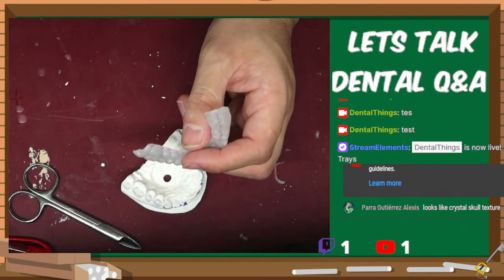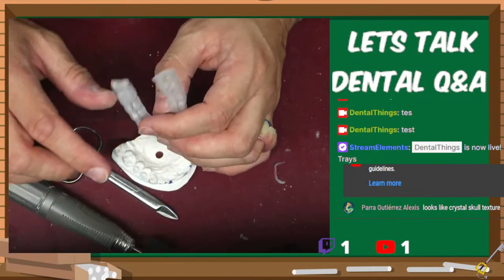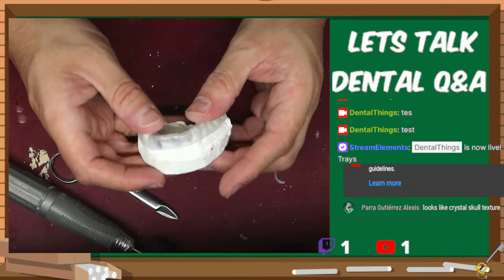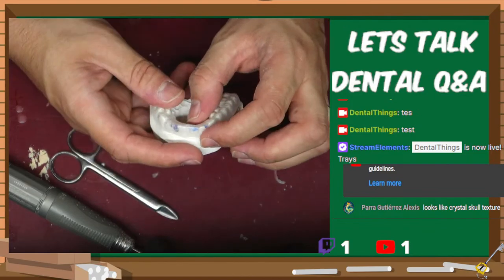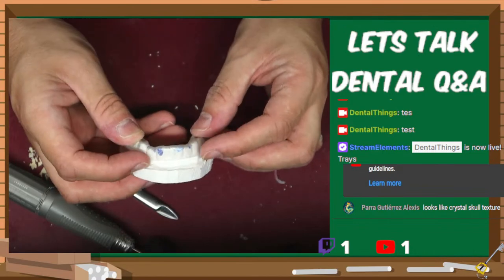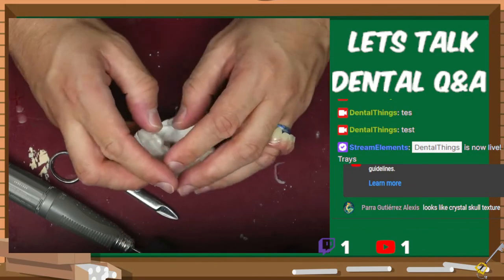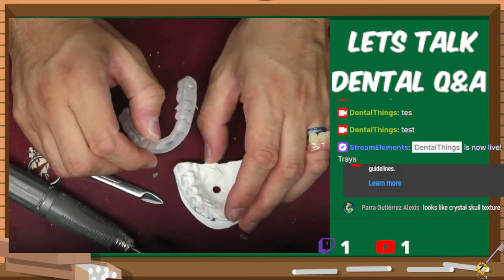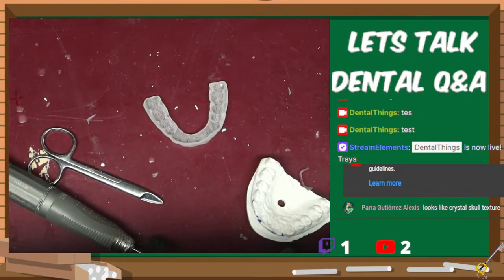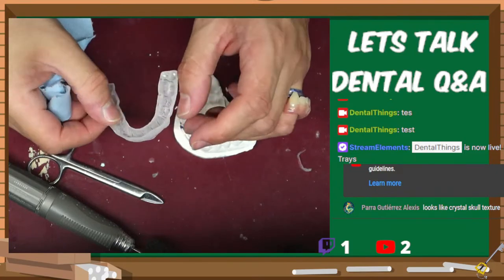Cool. And I can go in, reapply, and try. That feels better. Okay. Let me give this a little bit of a rinse, and let me give my model a little bit of a rinse so I can kind of get it to not be as cloudy.